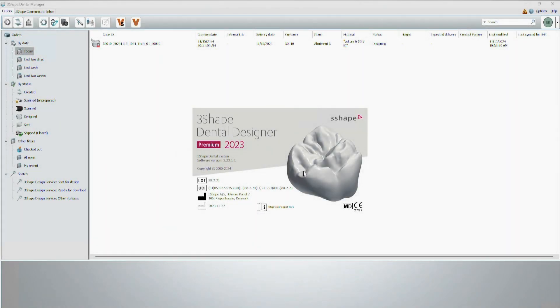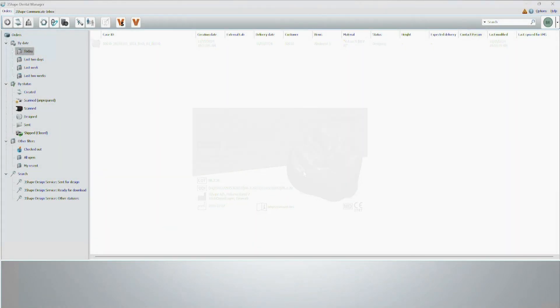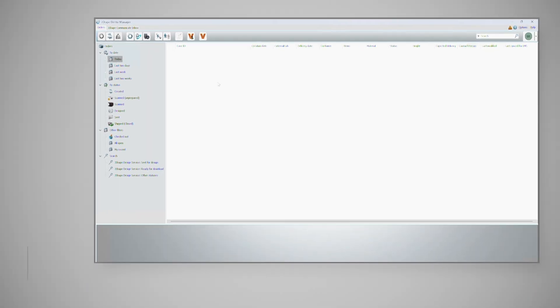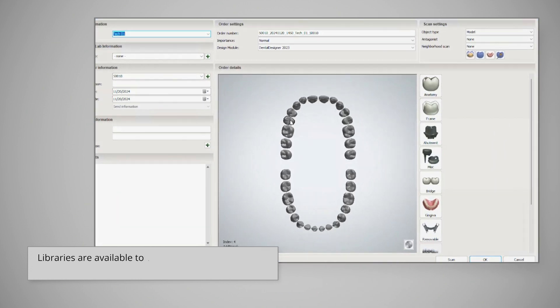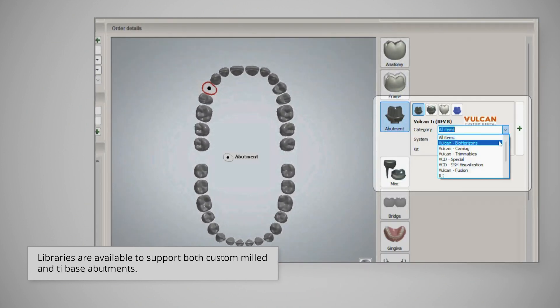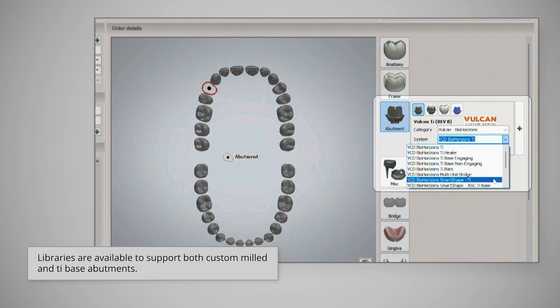Once the impression has been converted to a digital model and loaded into a restorative design software, use libraries from Vulcan Custom Dental for scan body alignment and final abutment design. Make sure to select the system with BioHorizons SmartShape in the title.